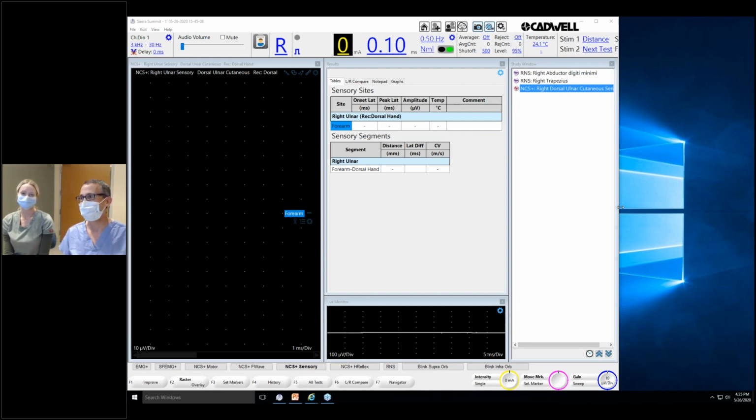And we understand that there were a lot of comments that weren't read to us, and suggestions and chats and tips that people were sharing. And some of you may have shared some of those tips. But we were bothered by it, and what we did is the next day we came back into the machine and we used ultrasound, and we followed my ulnar nerve, and we found the dorsal ulnar cutaneous branch coming off of the ulnar nerve.